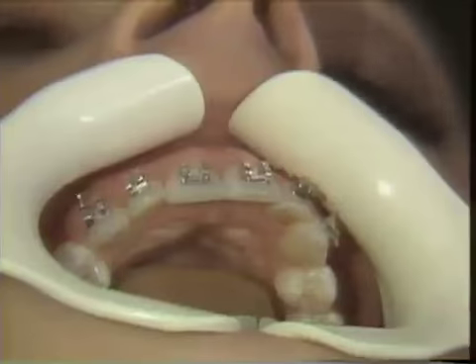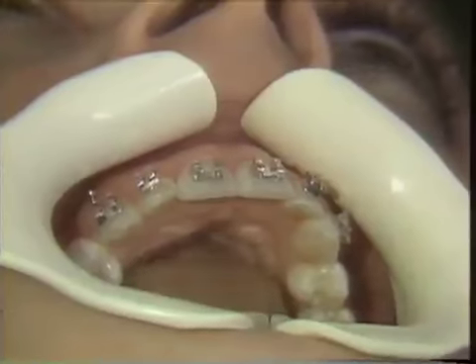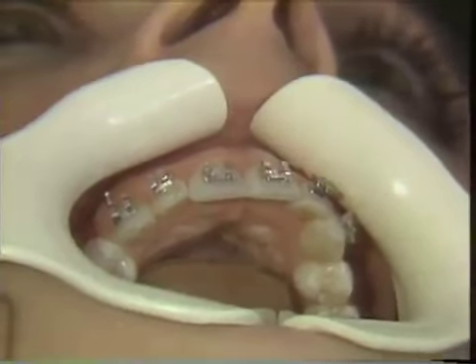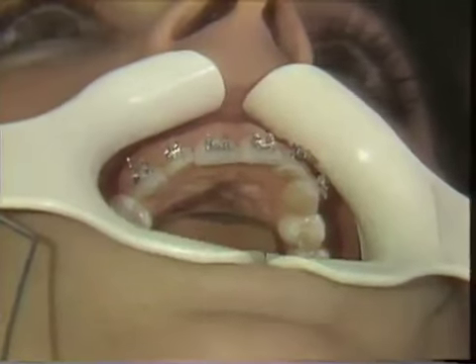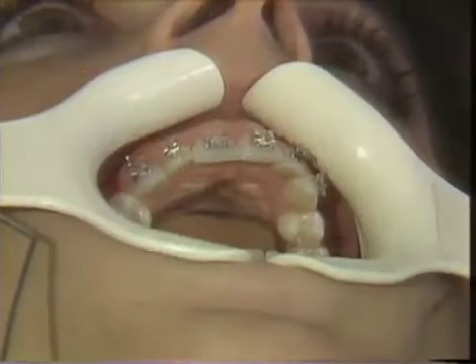How long do we have to wait until the arch wire can be placed in the mouth? The rule of thumb is that you can determine if you have some excess adhesive on the mixing pad. Once that has hardened on the mixing pad, you can take the isolation out and then wait 5 full minutes after you've placed the final bracket, and then you can tie an active arch wire in.